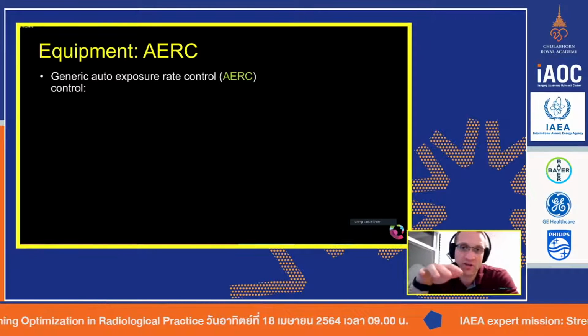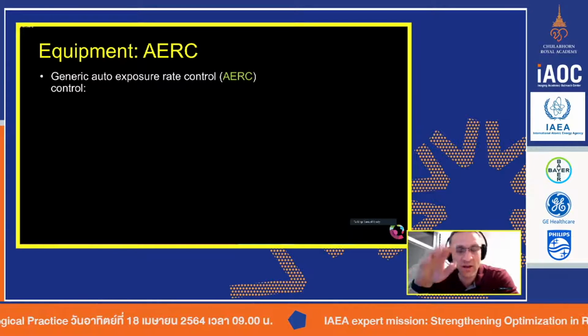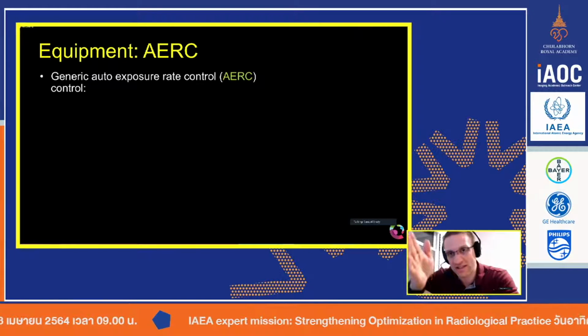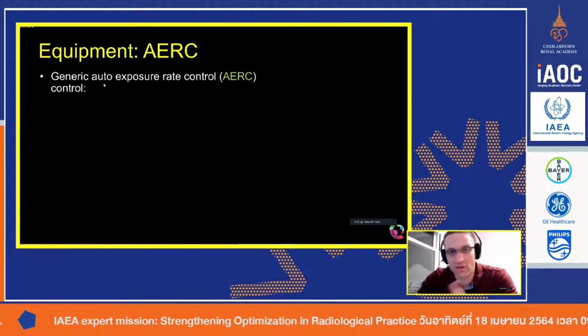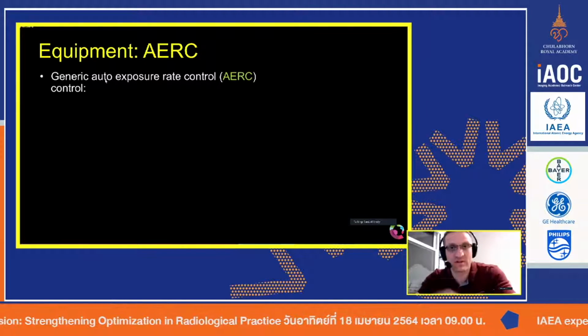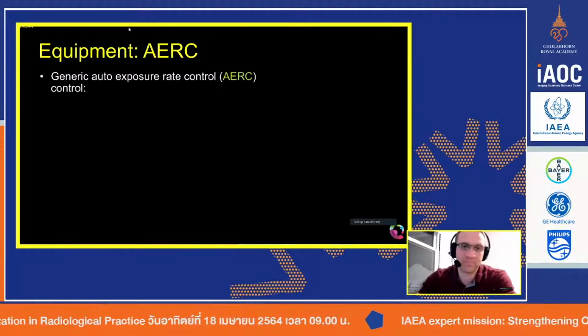And they need to make sure it's comparable as they go from 30, 15, 7.5. And once they get to about 7.5, 6, they need to make sure it's the same thereafter. That will make sure the noise, the contrast to noise and the signal to noise, all of these metrics we've been talking about, will all be optimized.